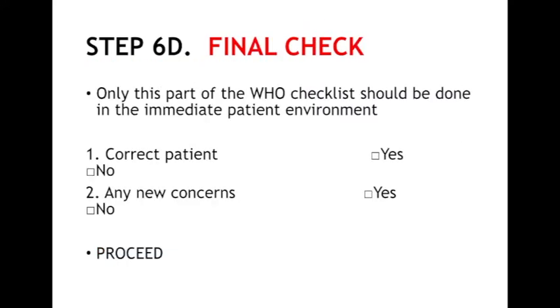Once the team have donned their PPE, the patient environment is entered and the WHO checklist is completed by identifying that this is the correct patient and if there are any new concerns present. If none are identified, then the procedure can commence.